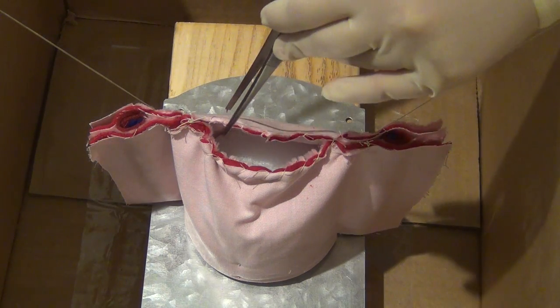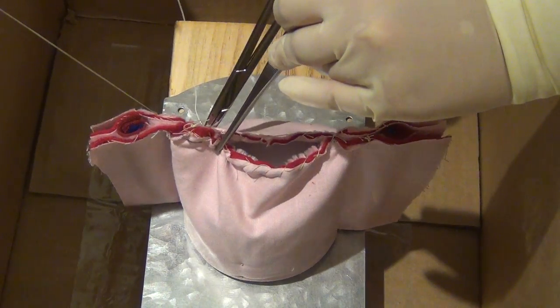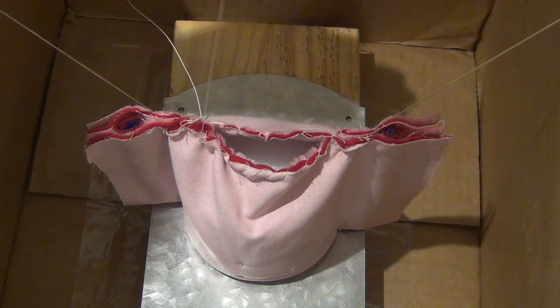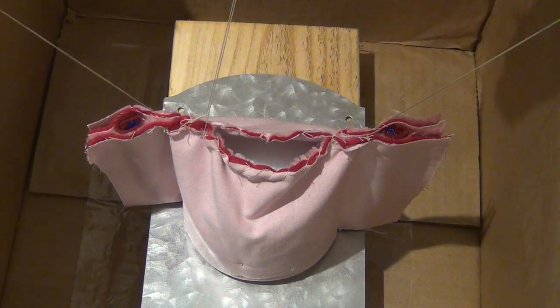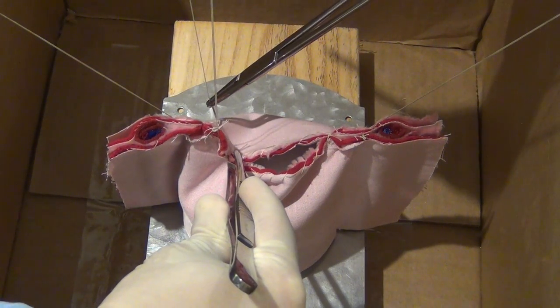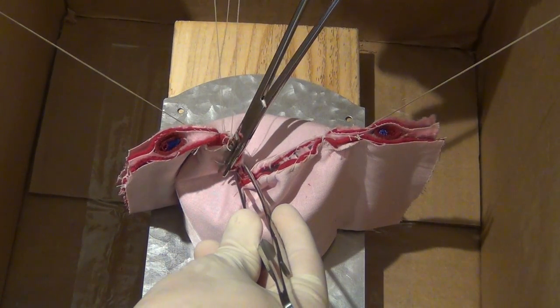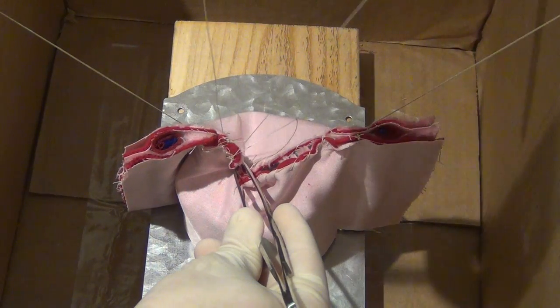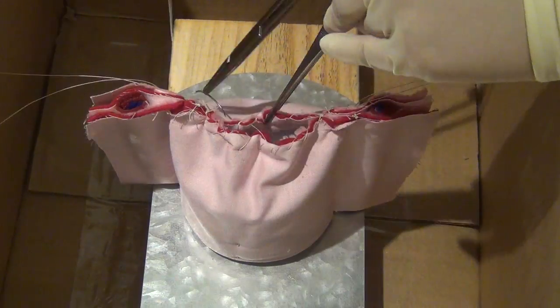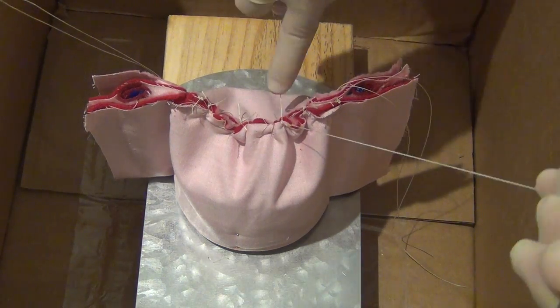The vagina is then closed using interrupted figure of eight sutures. A bite is taken through the anterior and posterior portion of the vagina and another bite in the same direction is then placed. This is then tied down, closing the anterior and posterior portions of the vagina. These sutures can be held or cut. This process is repeated several more times until the entire cuff is closed.